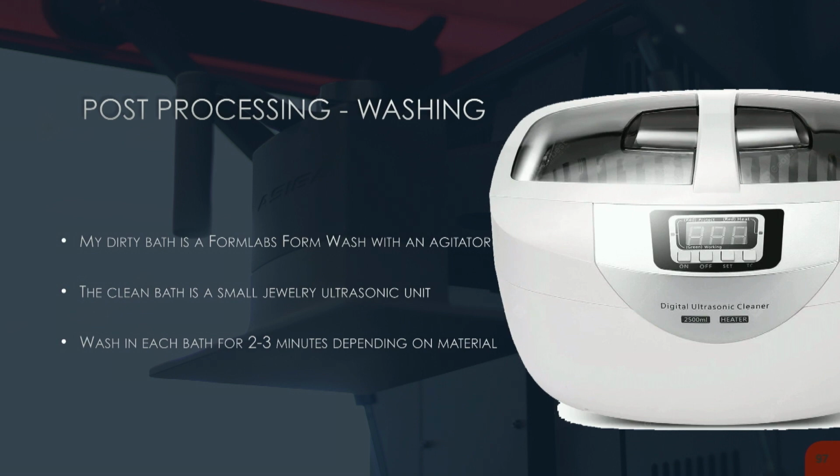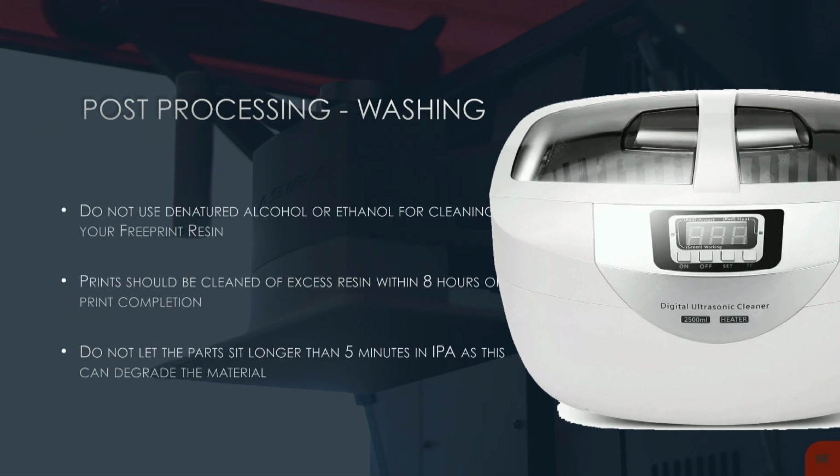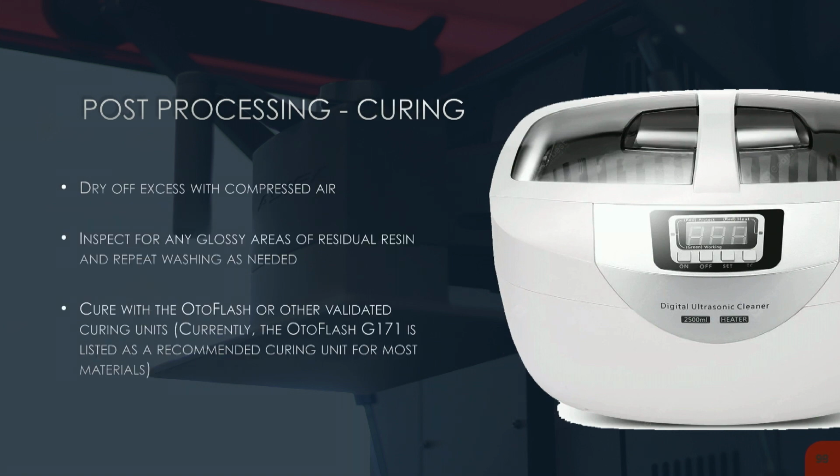Because again, they are polymers, and polymers and solvents do not play nicely together. So what they find very often, especially with these new permanent crown resins, is when you toss them inside of a solvent for a very long time, the polymer chains actually start to break down and weaken, right? So you want to wash it for as little as possible, but to get the cleanest result possible. So cleaning, very, very, very important.